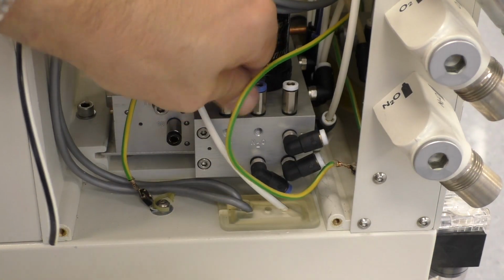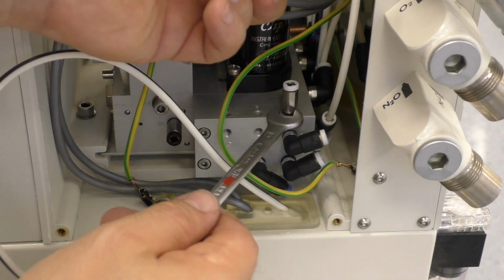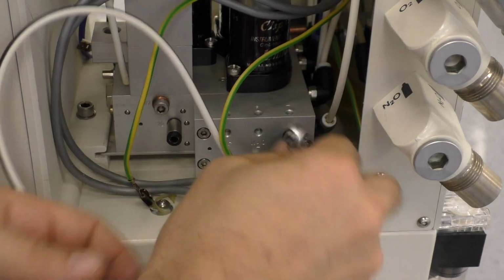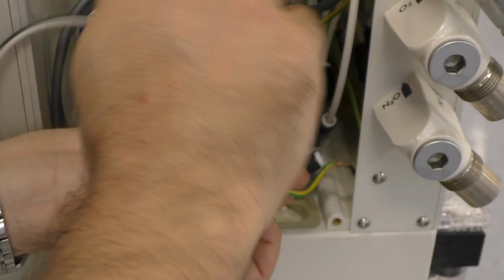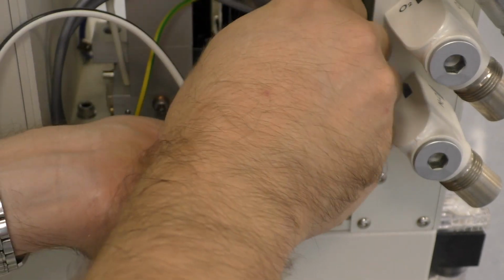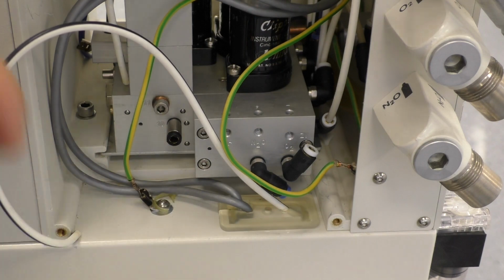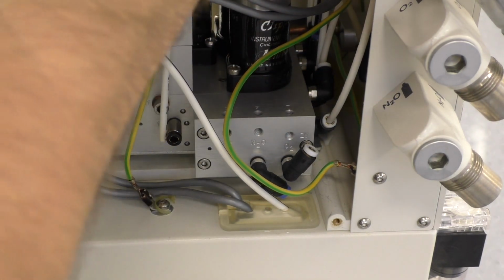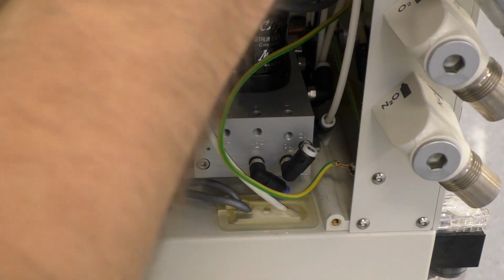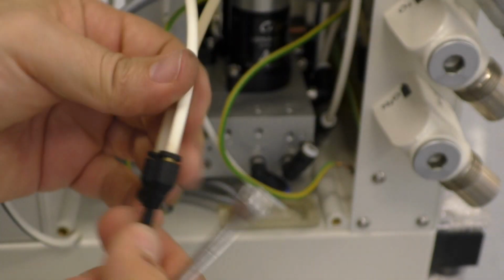And for the straight ones, it's about the same. Just take a number 8 millimeter key wrench and you're in like Flynn, or whoever that Flynn guy is. Okay, come on. And the best part of all are the little adapter thingies here, like this one, which is a little bit difficult to reach if you don't have the right tool. Okay, like this.